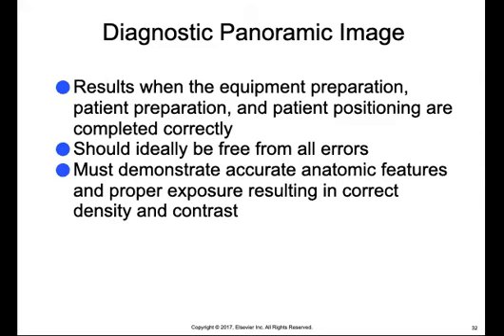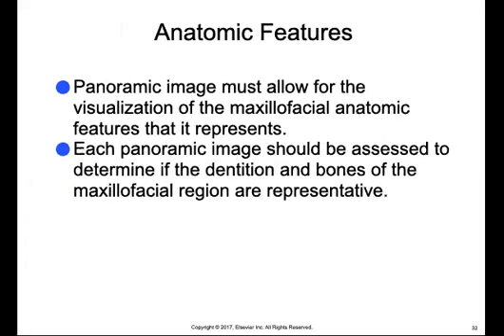A diagnostic panoramic image must demonstrate accurate anatomic features and proper exposure, resulting in correct density and contrast. A panoramic image must allow for the visualization of the maxillofacial anatomic features that it represents.